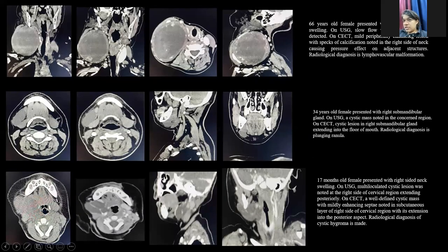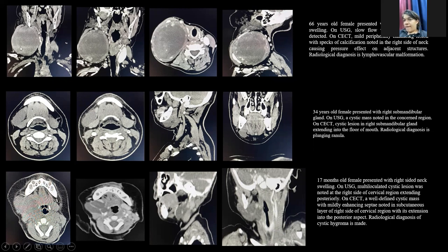A 66-year-old female presented with right-sided neck swelling. Ultrasound showed slow-flow vascular malformation. On CECT, a mildly peripherally enhancing lesion with specks of calcification was noted in the right side of the neck. The diagnosis of lymphovascular malformation was made.